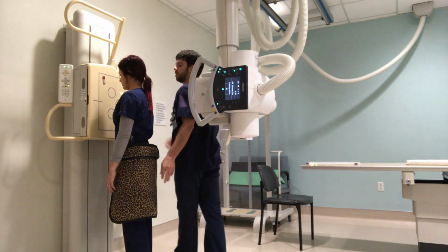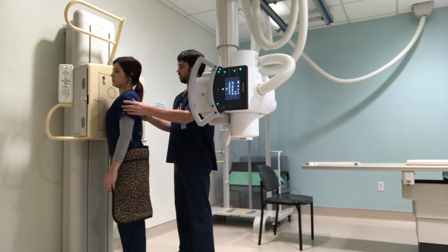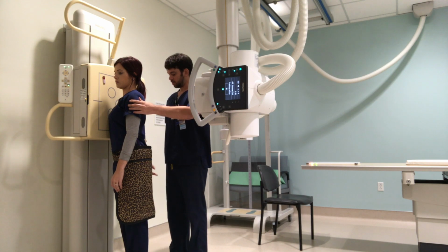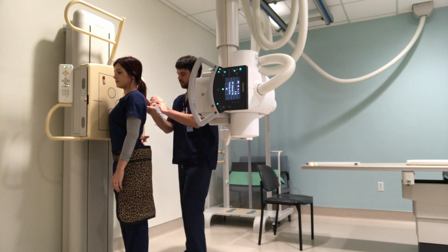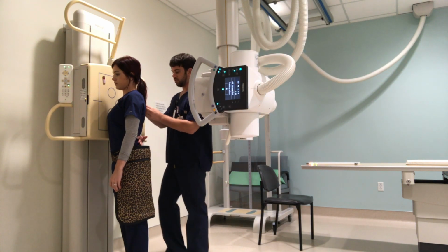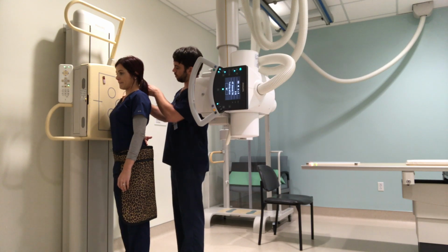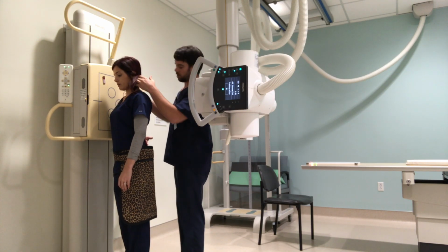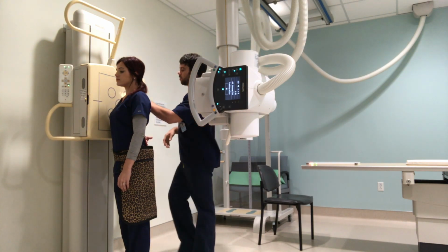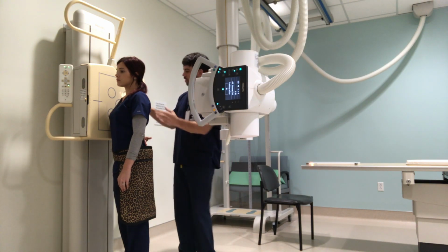For this one, I should be rotating the patient about 45 to 60 degrees depending on the patient. She's fairly small. Is there any way you can stick your hand behind you like that? Perfect, that's not too much pain? Okay, so that gives me a great protrusion of the medial border of the scapula here, and I'm just going to line that up with the acromion process to create a perpendicular line with the IR. This is going to be great to show displacement of the humeral head and dislocation of it completely.